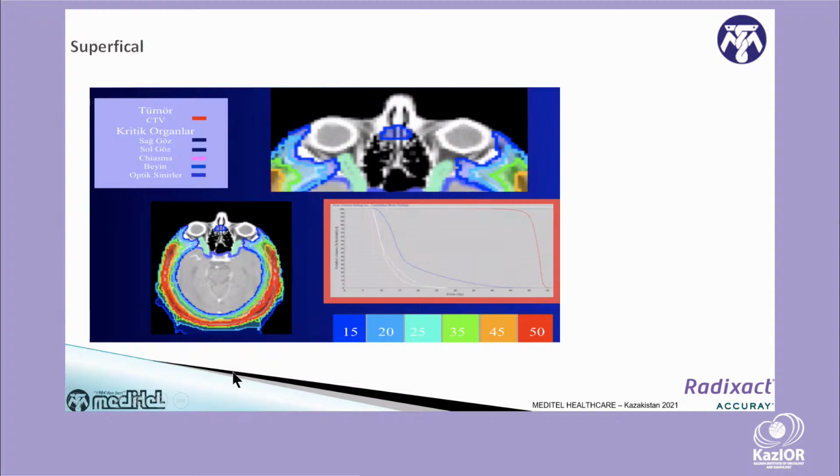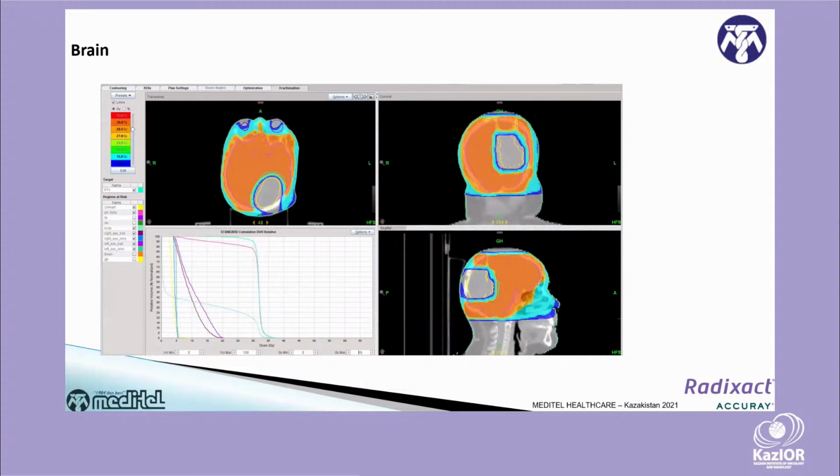And how it comes with this feature: because it doesn't have electron, it's very simple because it uses only tangential beamlets. As you can see, it uses this angle, and the beam goes like 5-6 cm in the scalp. Rather than if you use straight angles, the build-up region will be in the PTV. This is uncertain, it means uncertainty. Also, you accumulate the dose inside. So the system automatically decides tangential beams so that they go more in the PTV, and there is less uncertainty in the dose calculation.